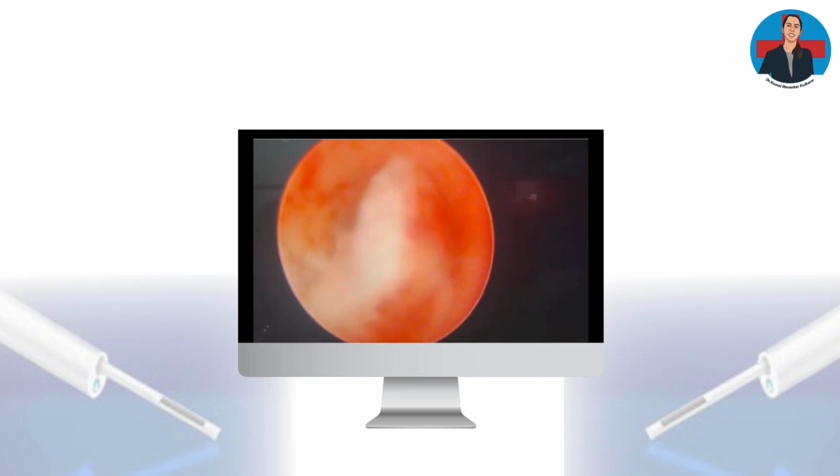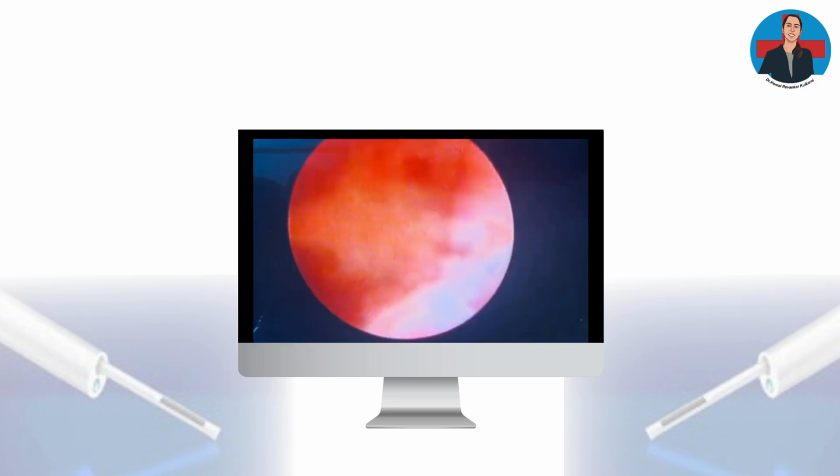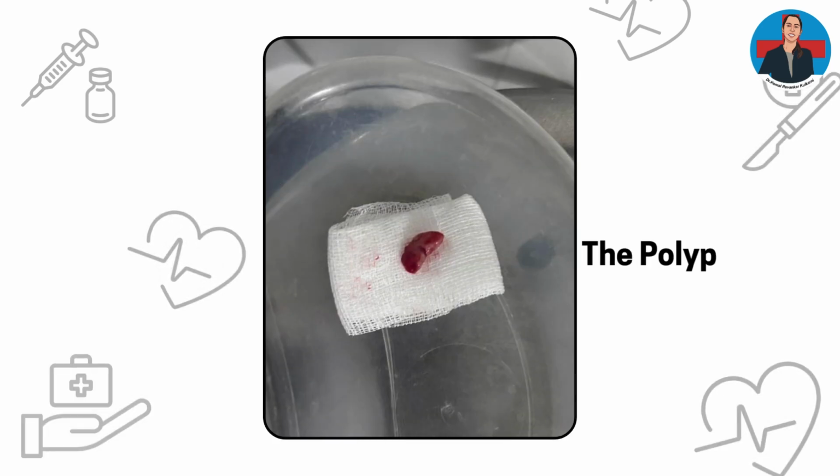base. And this is the final picture that you're seeing, a clear endometrial cavity, and the patient gets discharged the same day.